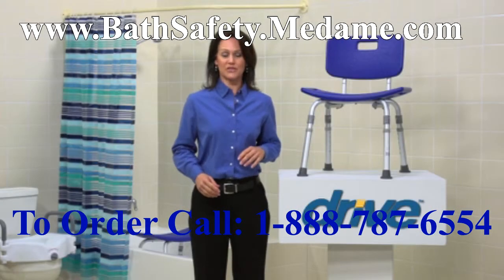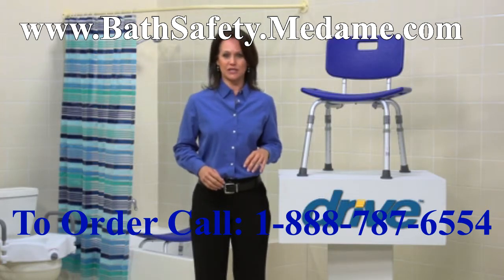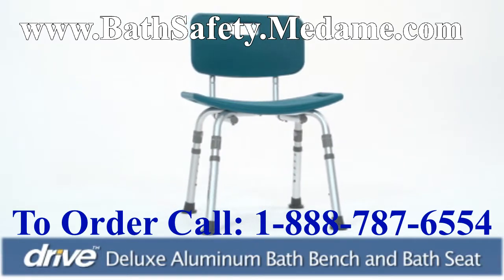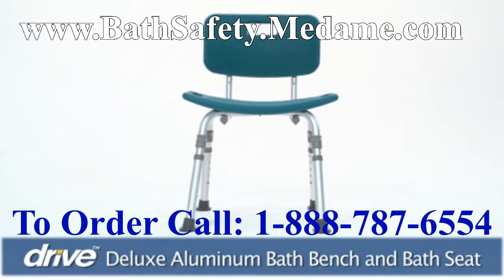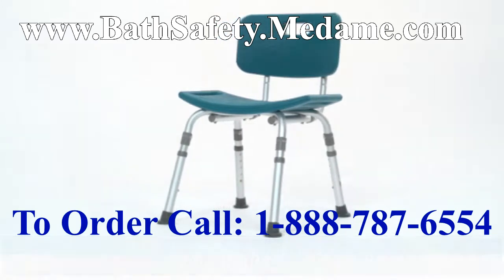Wet slippery bathroom surfaces can increase the risk of falling. For those who desire more security while bathing, a bath bench or seat is an excellent solution. To enhance your comfort and safety, the Drive Medical Shower or Tub Bath Seat and Bench provides a perfect solution for wet slippery bathroom surfaces.